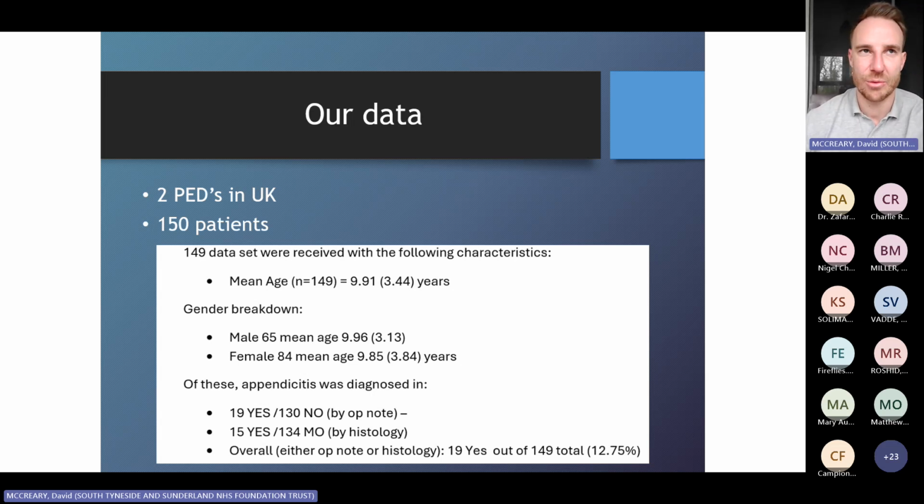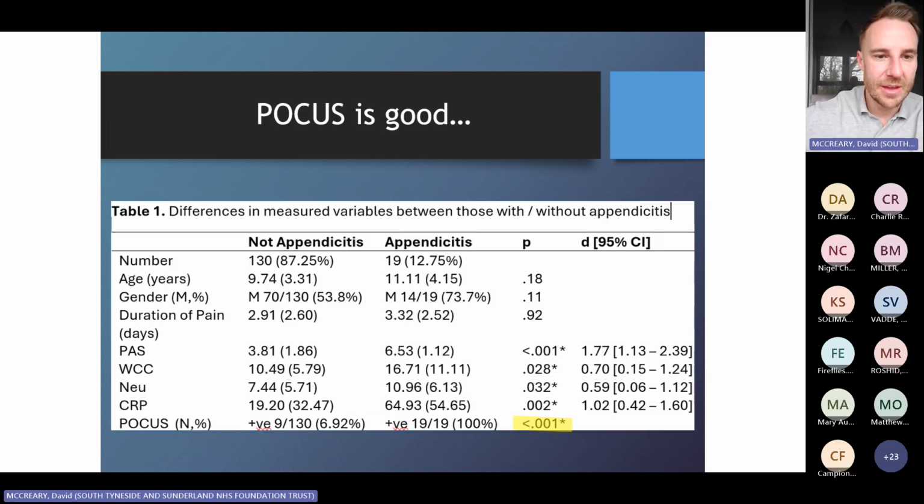I think that's about right, because that really does fit with, just by fluke, all of the prevalences that you read, in terms of we're not scanning too many, just anyone willy-nilly, and we're not always getting appendicitis. That would be a worry if everyone we were scanning had appendicitis. It probably means we're not doing enough. And then just some data here. I just want you to focus on the difference.